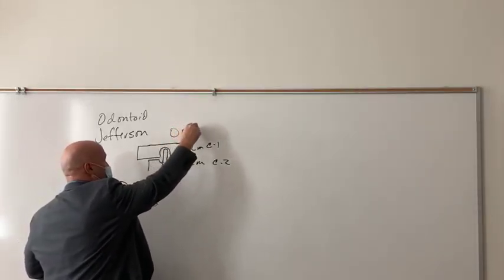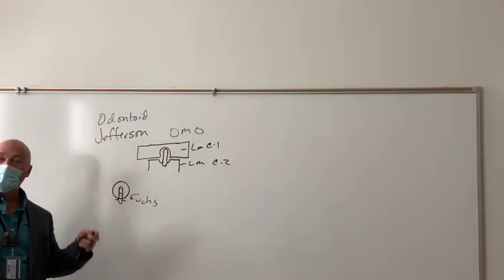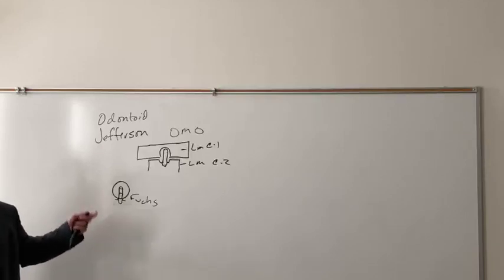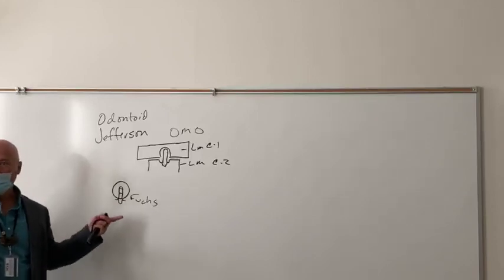This is open mouth odontoid. Okay, so some of the protocols are to shoot a Fuchs. Yes, shoot a Fuchs when all other possibilities are exhausted, and only then do you shoot a Fuchs, or if somebody requests it. So I can't say it's worthless anymore because it's protocol in some hospitals.